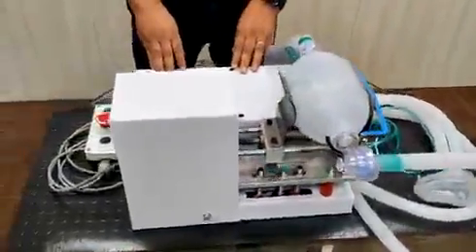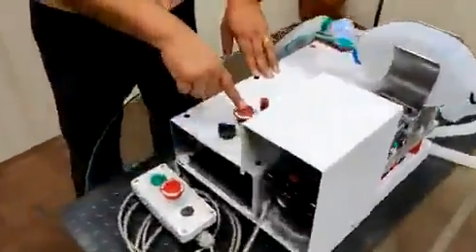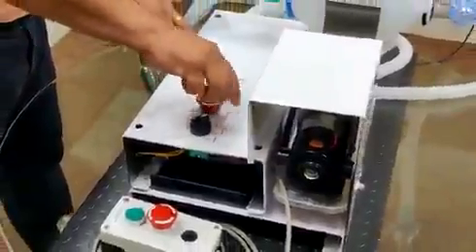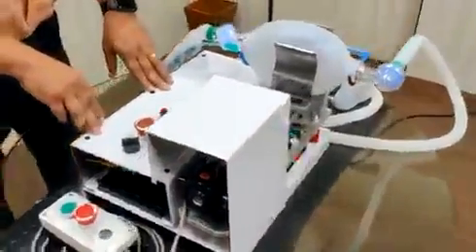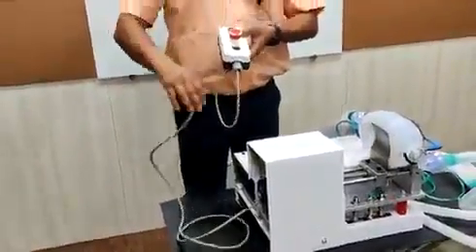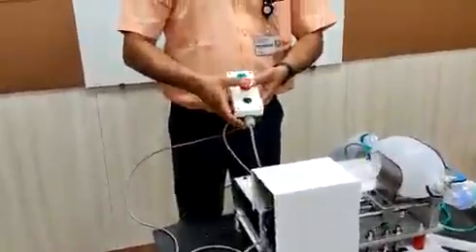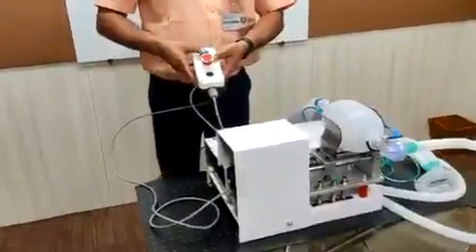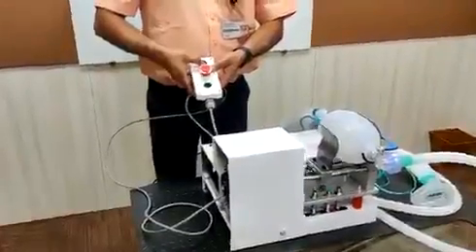We have provided an emergency stop button and a pendant as well. There is also a doctor's call button for the ease of the patient.